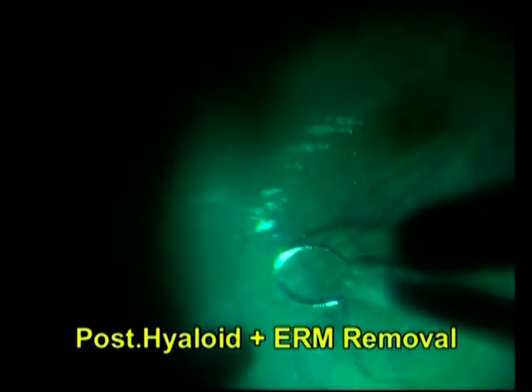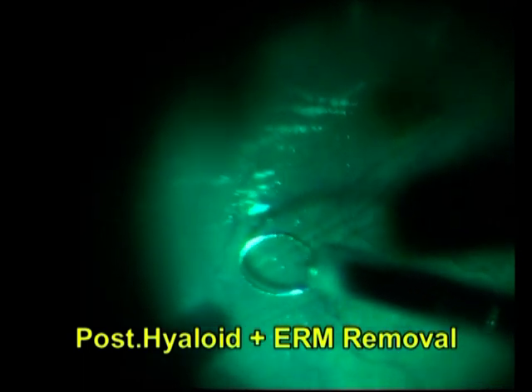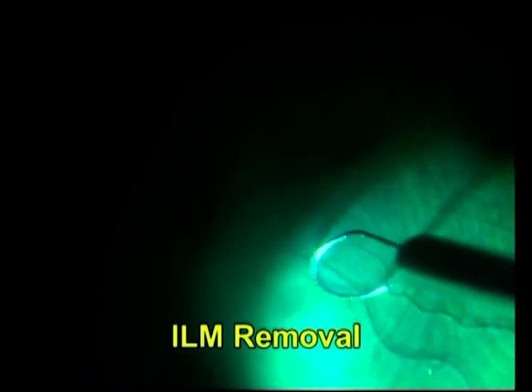The surgeon started the surgery by intravitreal triamcinolone-assisted PVD induction, followed by posterior hyaloid and ERM peeling. After this, Brilliant Blue staining of the ILM was done and peeling started with the plan to preserve a small piece of ILM for the inverted flap.